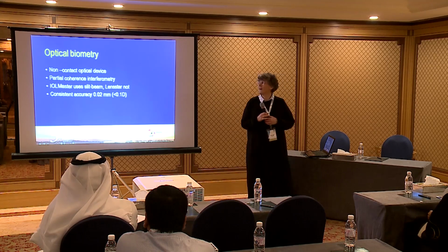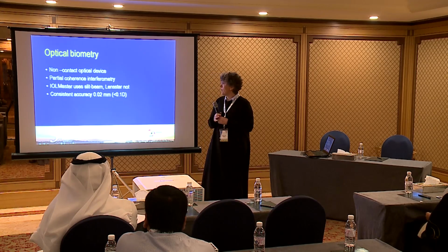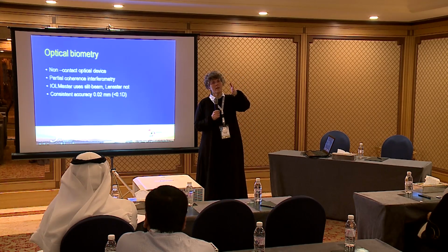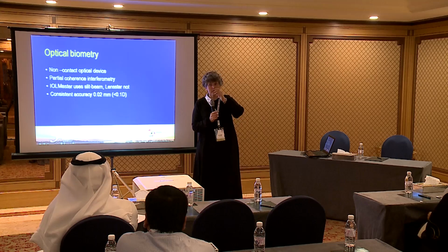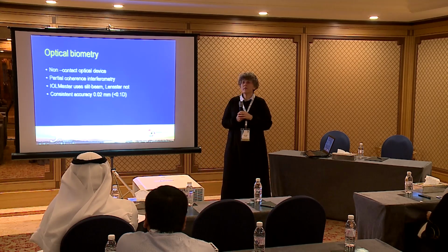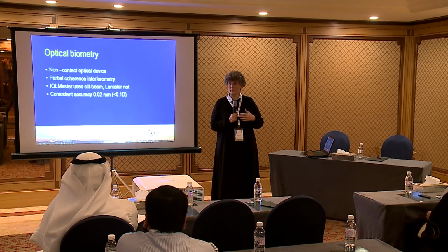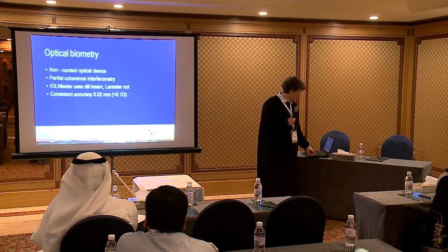Now, the non-contact optical device works with partial coherence interferometry. So the IOL Master uses a beam that's going in, and that's being split and then measured, and the Lenstar does a direct measurement. It's a technical difference. Both of them are very accurate, and the consistency is below 0.02 millimeters. It's a 10 or 8-fold improvement on the ultrasound.